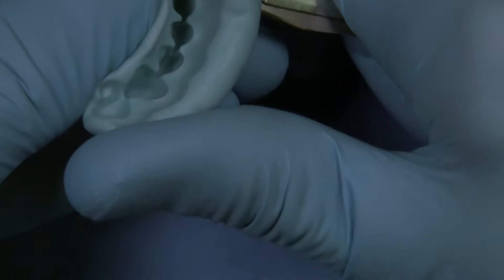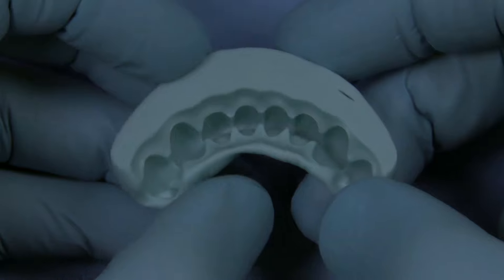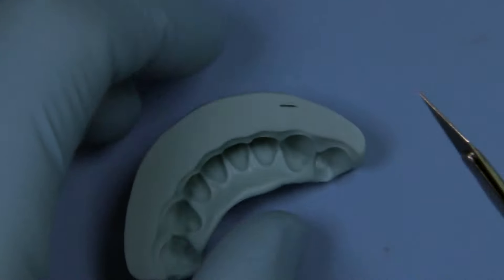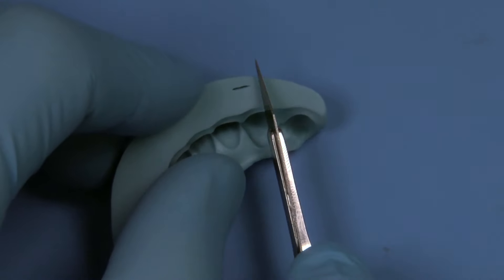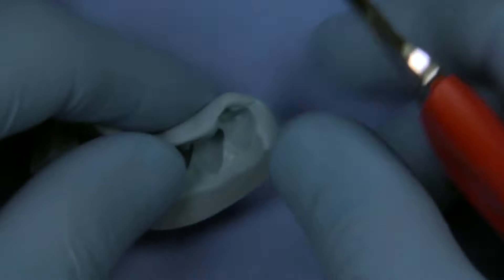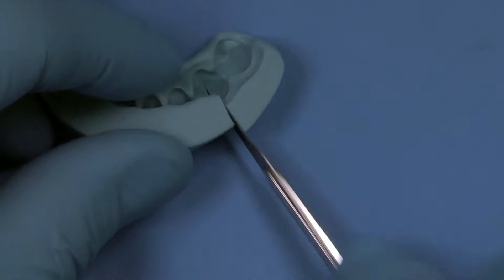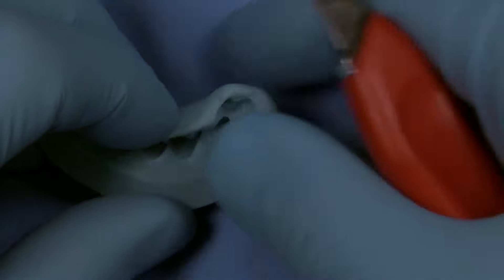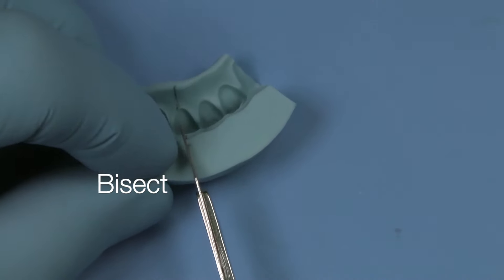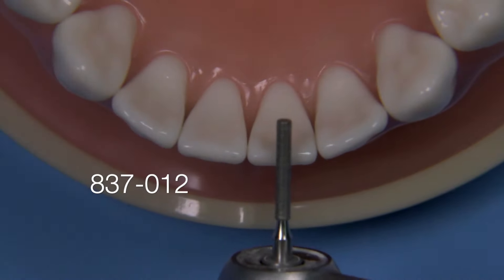Typically I'm going to be making this on the diagnostic wax-up or the digital model that we'll fabricate through our digital smile design approach. Just go ahead and trim this so that you don't have a lot of excess material to get back into the mouth. Remember that even though we're making this on a typodont, this is going to have to fit into a patient's mouth. In this particular case we're going to do just a simple bisection so we can utilize this from the side.